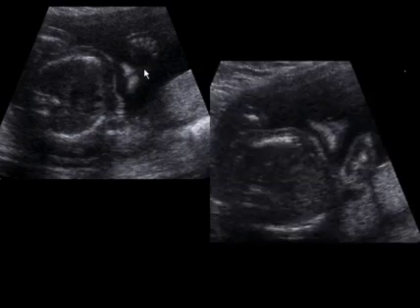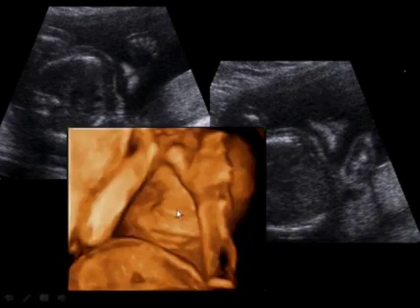But if we scan a little bit more posteriorly, we can see that actually the lip is completely intact when I have the nose on the image, and this is just a prominent philtrum, or that cleft in the soft tissue in the upper lip. And it can be confirmed, if possible, with 3D imaging. Here's an image of the fetal face, and we can see that the upper lip is completely intact.